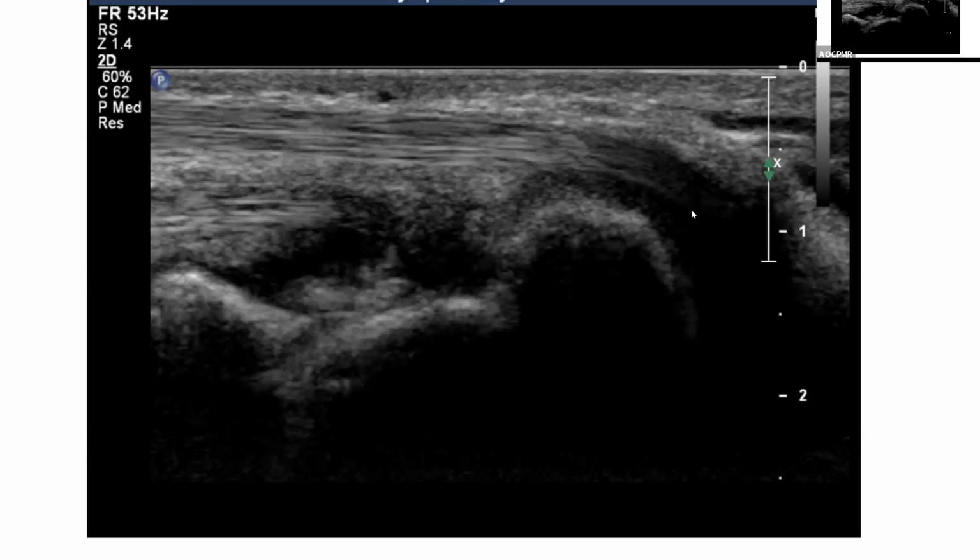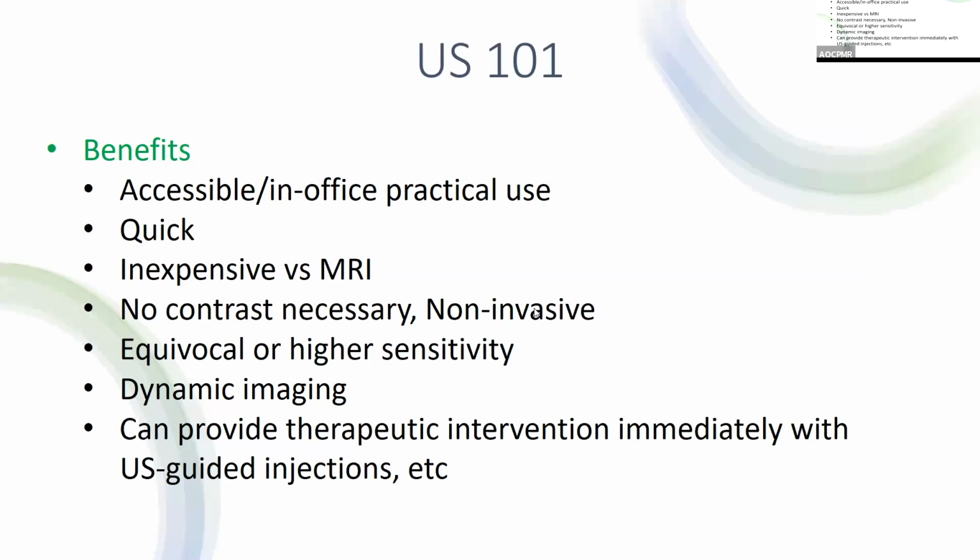These are some fibularis longus and brevis tendons wrapping around the lateral malleolus, excuse me. And you can see as they start to curve, they become darker, more hypoechoic until they become anechoic. It's not that these tendons aren't here. It's just that these sound waves are bouncing off and not coming back. Cool. Really beneficial and cheap.